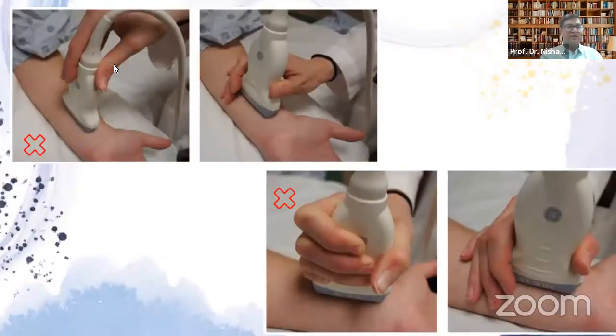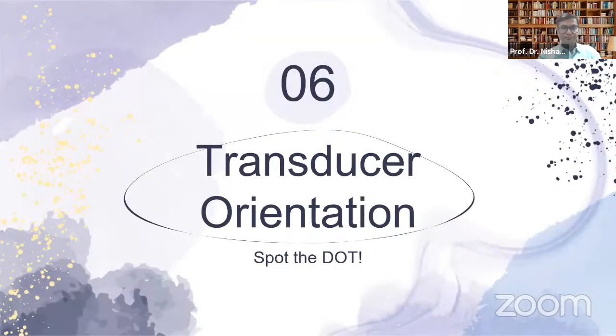If you see this, if you hold it like this, the movement of the bottom of the probe, which is acquiring the image, is wobbly. If you use it like this, you're holding the probe almost like a pen. The wrist is straight and you have better control. Again, holding it with the thumb like that restricts your wrist movements. But here, your wrist is free and the probe is well balanced and well stabilized on the tissue interface, so you get better images.